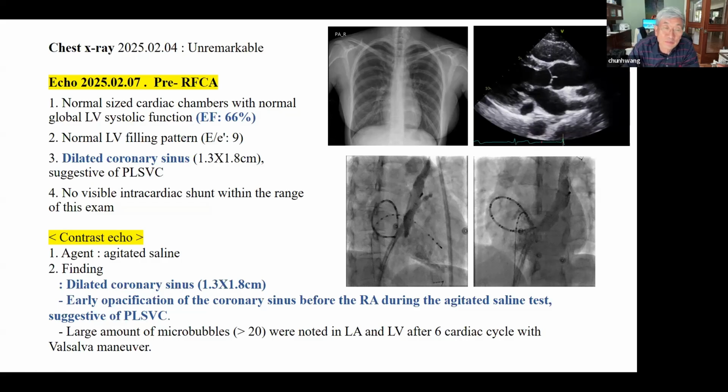So you used intracardiac echo, it looks like, or TEE. What did you use? Did you use intracardiac echo to look at this, or just angiographically? Angiography. Okay. All right. Go ahead.